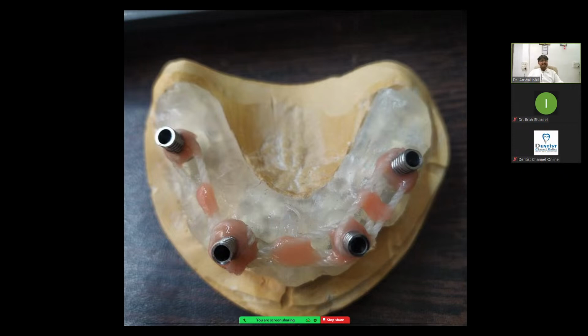So just take an impression. There is one strip of glass fibers available that you just wrap around the abutment and cure with the light, so it becomes harder. Then you send it for acrylization, or do a jaw relation and mount, and then go for acrylization. So the next day you can fix the prosthetic, which has a base structure inside it.